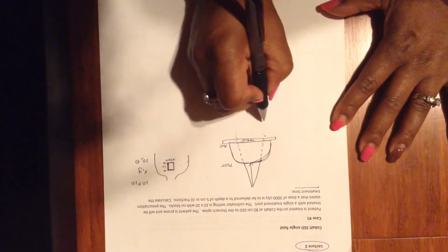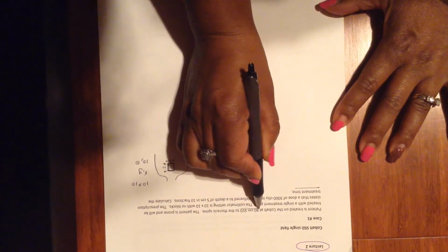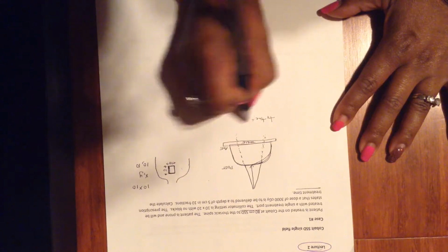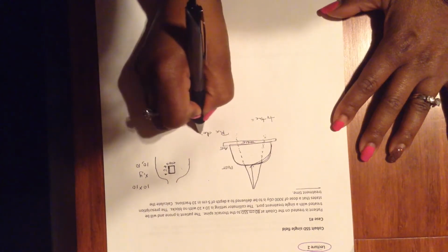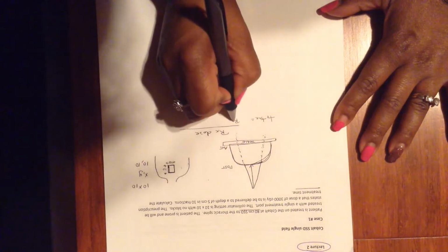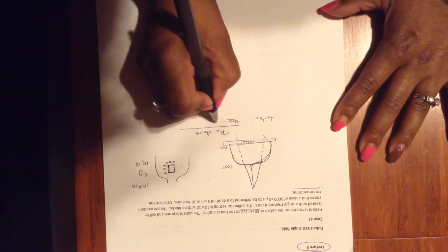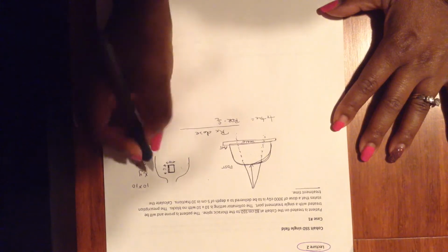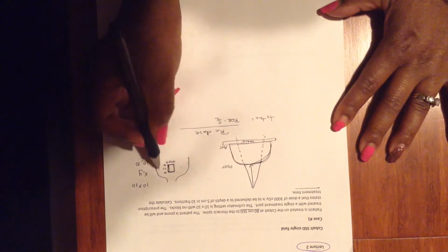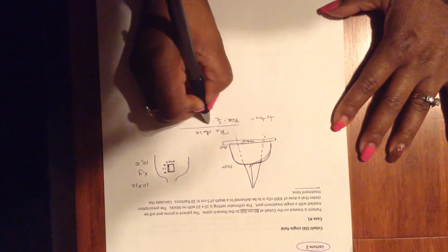So we need the treatment time formula, and we also need to recognize that this is an SSD technique. The treatment time formula would look like this: treatment time, the prescription dose, and then those factors along the bottom, remember? We're going to have to find the reference dose rate for Cobalt using SSD technique. We're going to need the collimator scatter factor for this 10 by 10, and since the reference dose rate was probably taken with the 10 by 10, the collimator scatter factor is going to be, guess what? 1. Then we're going to need the phantom scatter factor.